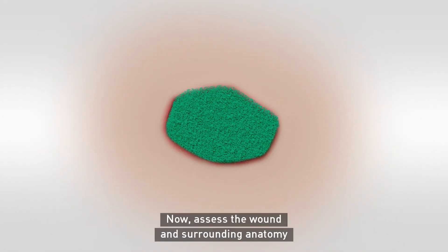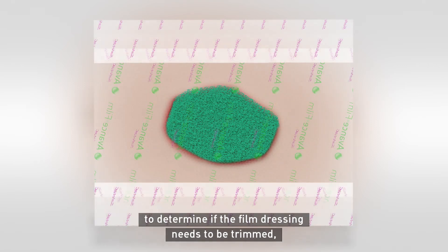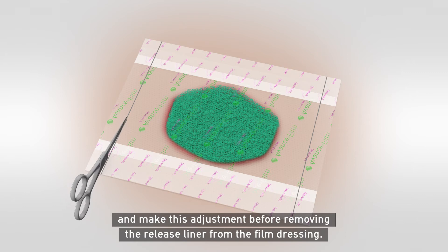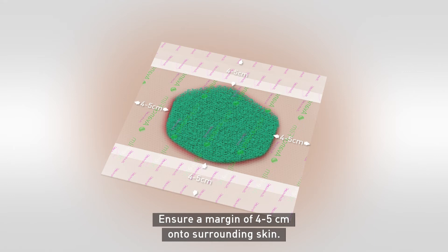Assess the wound and surrounding anatomy to determine if the film dressing needs to be trimmed, and make this adjustment before removing the release liner from the film dressing. Ensure a margin of 4–5cm onto surrounding skin.